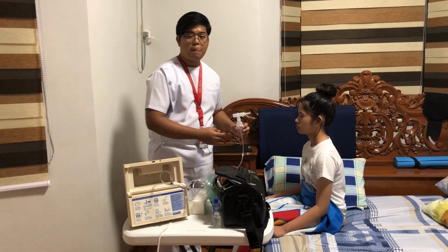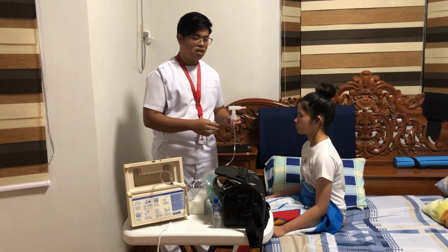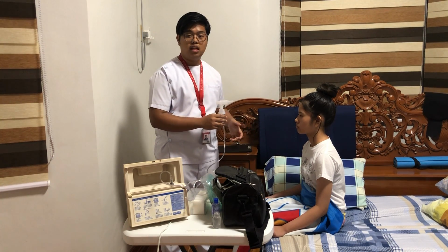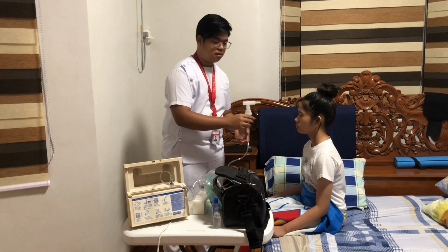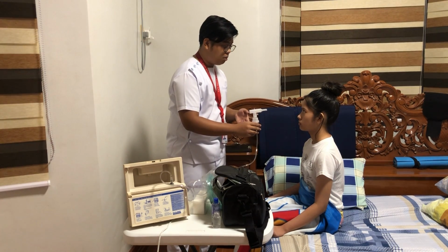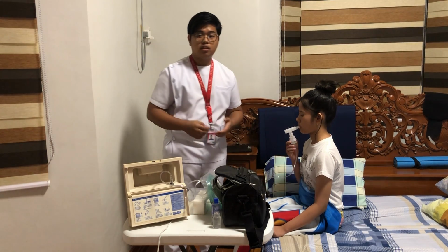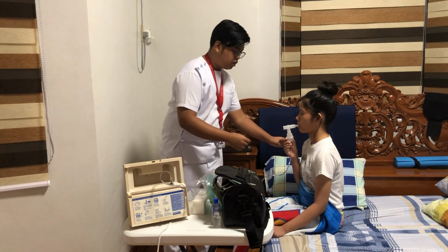it to our patient. And then we need to instruct our patient that using her teeth and lips, she needs to hold in or grasp into the mouthpiece. Ma'am, using your lips or teeth, you need to grasp well on our mouthpiece. And then afterwards, you can use your hand, ma'am.